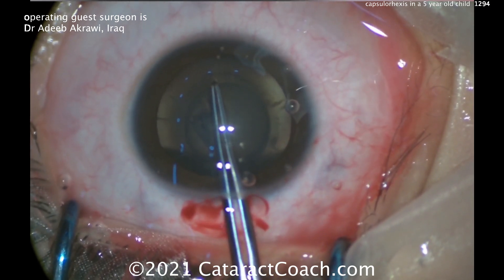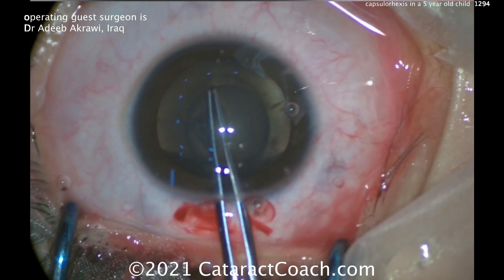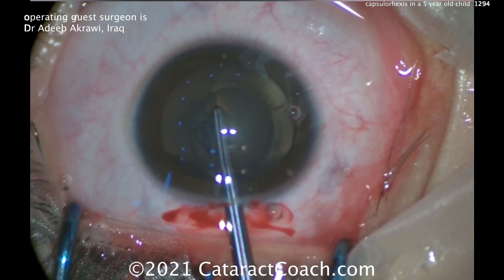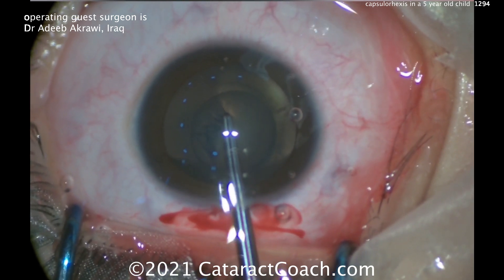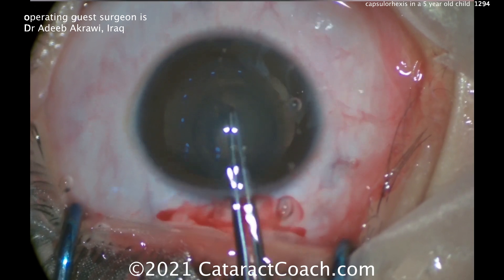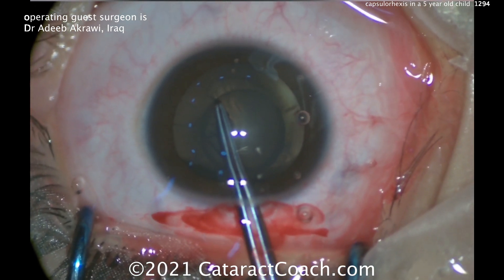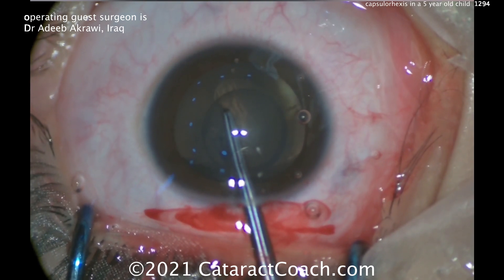You can see how he's pulling inwards with that rexis edge, because otherwise it wants to run out. It's very different than in an adult. This capsule is so elastic — look, he's pulling inward, look at the angle he's pulling — and still it wants to run away from him. So he's going to grab it again and finish it, and he's going to have a beautiful result here.